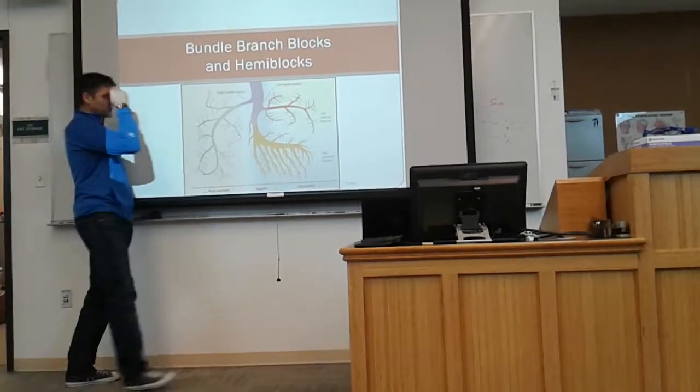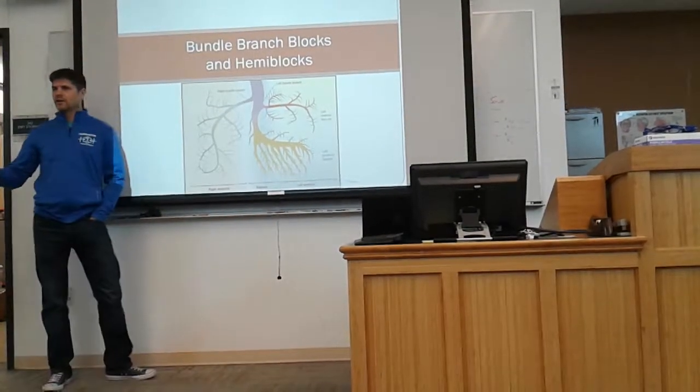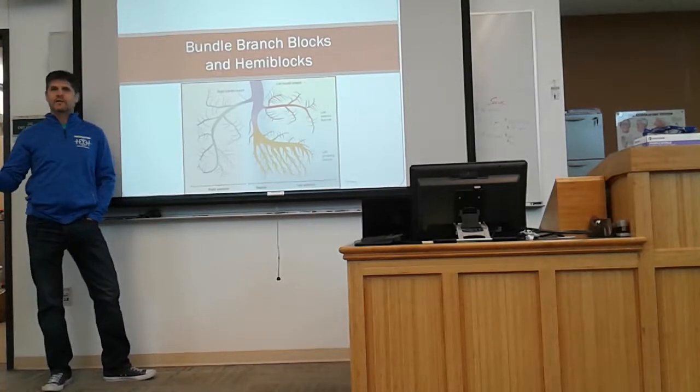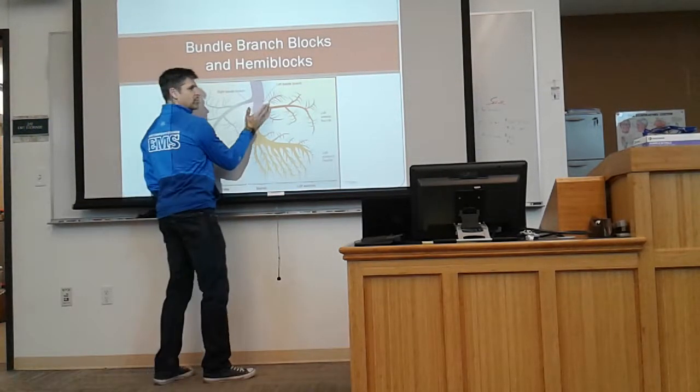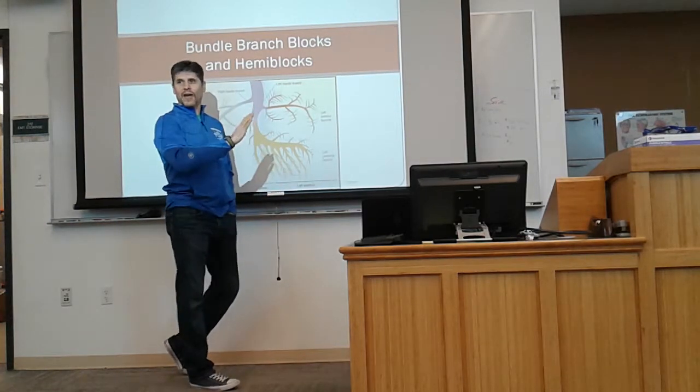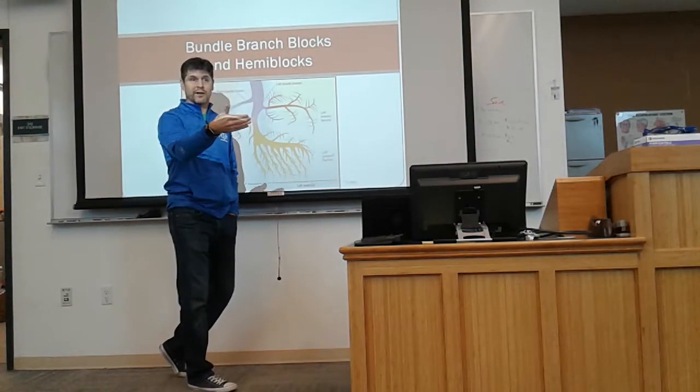It could be a situation where the right side is working normally, and it starts a QRS complex because it happened fast like it was supposed to, but the left side was blocked, so we didn't see it in the mix at that point in time, but it starts to come later.